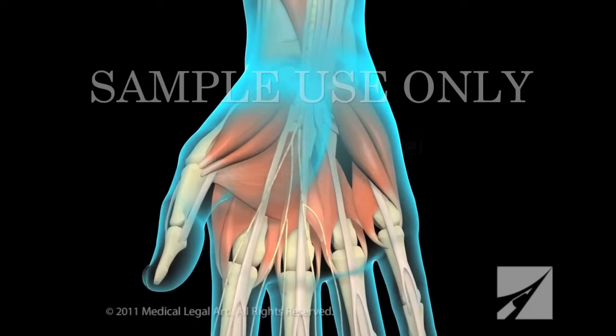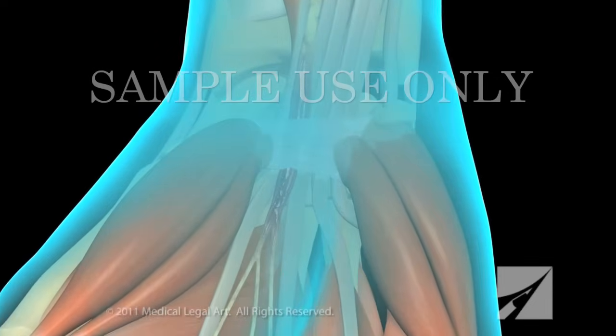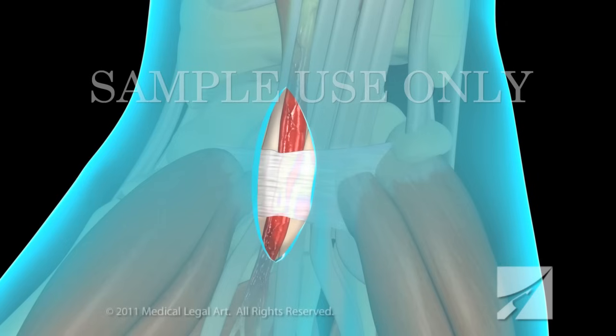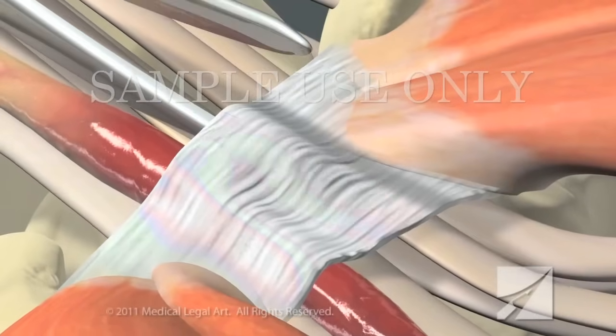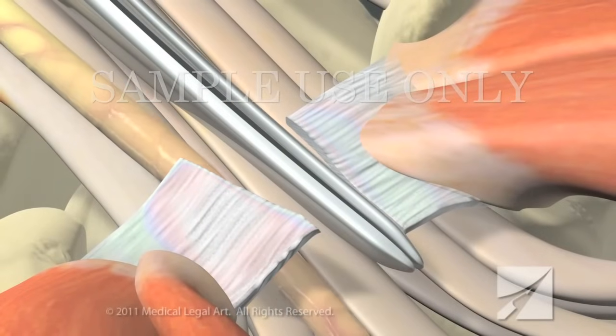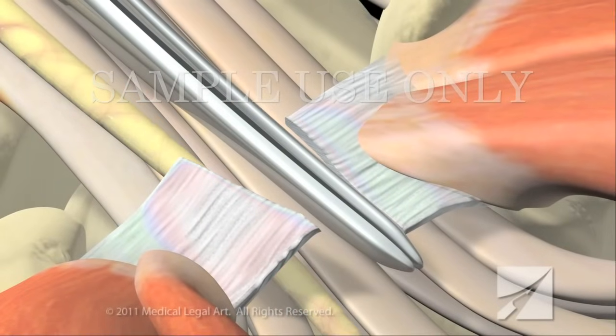There are two ways to perform the surgery. In the traditional open procedure, your surgeon will begin by making a single incision in your palm and wrist. He or she will then dissect through the underlying tissues to reach the transverse carpal ligament and cut it, thus creating more room for the median nerve.